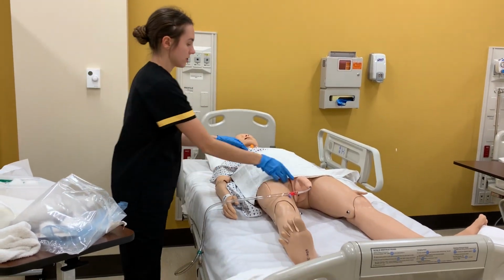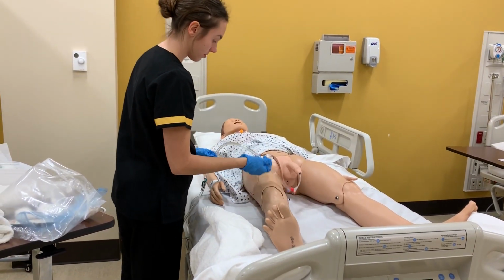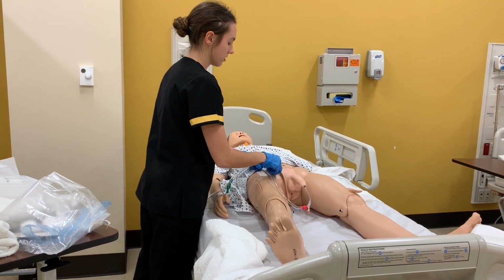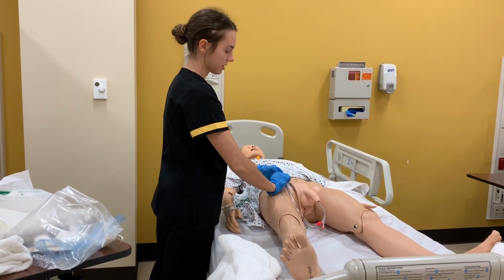Okay, so Mr. Benjamin, I'm going to secure this with a little bit of slack there so you won't have any trouble. And if we didn't have one of these holders, we would just secure it with normal tape.